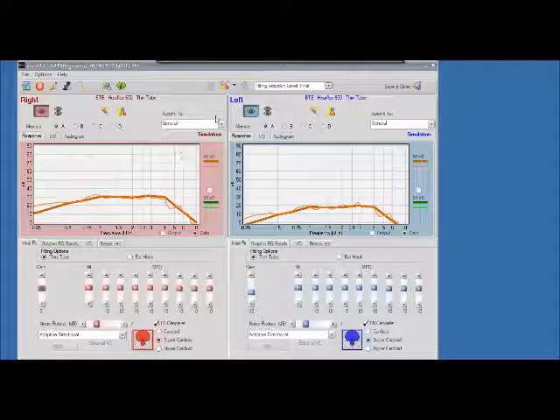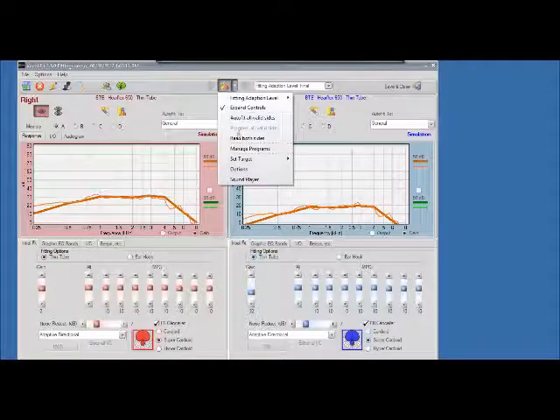Once you're done making adjustments to the device, as always, the patient will hear the changes as you make the changes in the aid or in the software, but it puts it into short-term memory. So before you're done, you can either go to Fitting Tools here and click Program All Valid Sides.